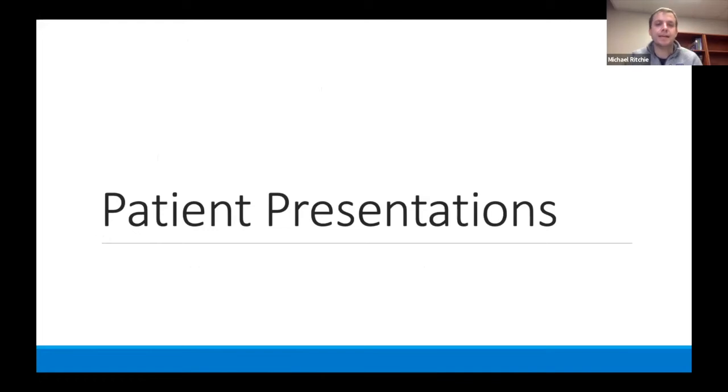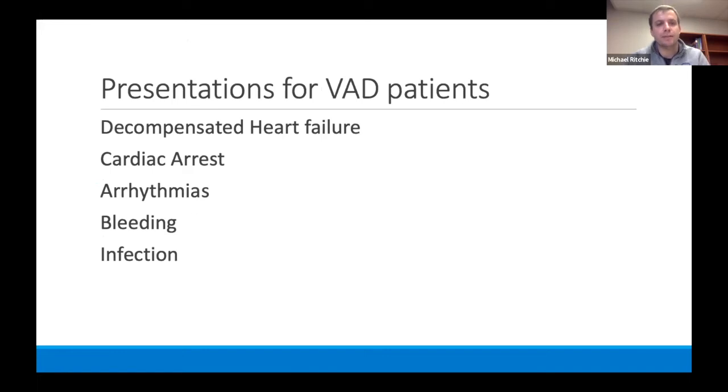Patient presentation. You may not have alarms at all, but the patient's going to present with different things. They can present with worsening heart failure, which is common. They can have cardiac arrest. Arrhythmias are very common, and then bleeding and infection are also very common.